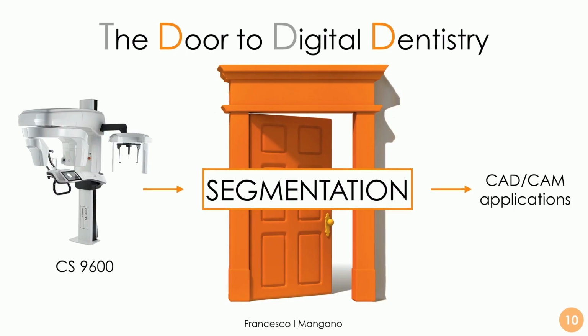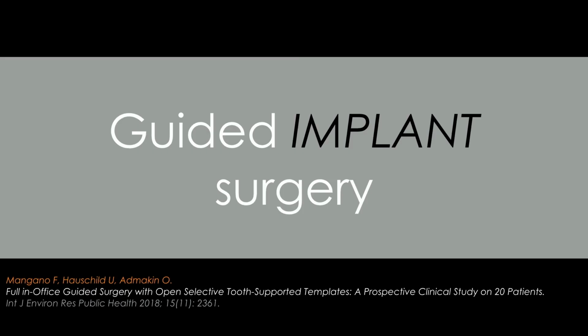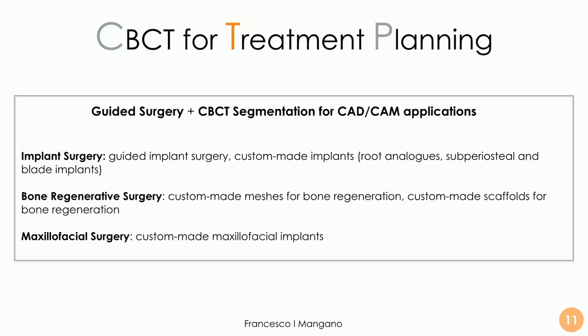So cone beam computed tomography can be considered a powerful tool for diagnosis, but also a very powerful tool for segmentation through the DICOM file, opening opportunities in computer-assisted design and computer-assisted manufacturing software for clinical application. And this is how it works with the treatment planning. For example, we can use the DICOM file for guided surgery, for segmentation, for computer-assisted design and computer-assisted manufacturing applications. Just a few examples.